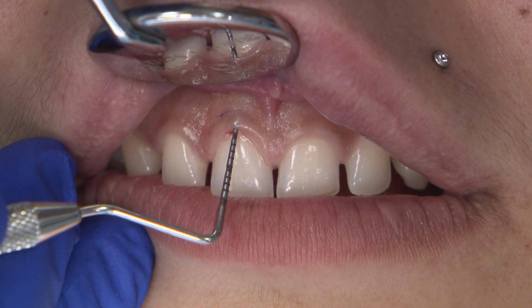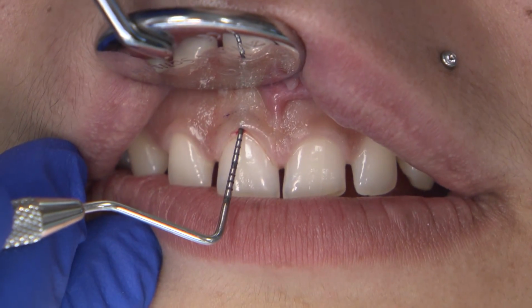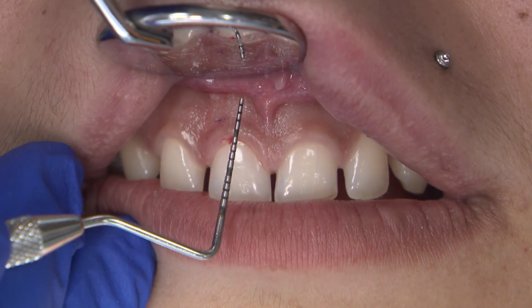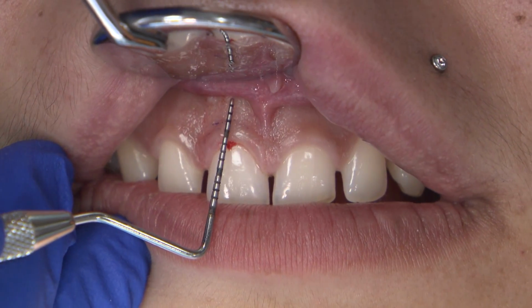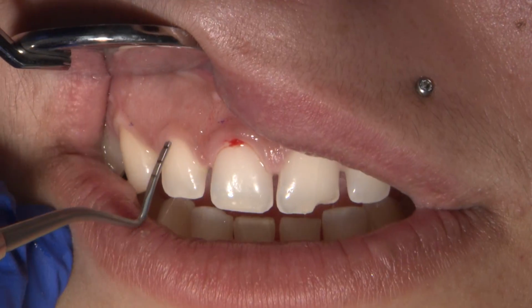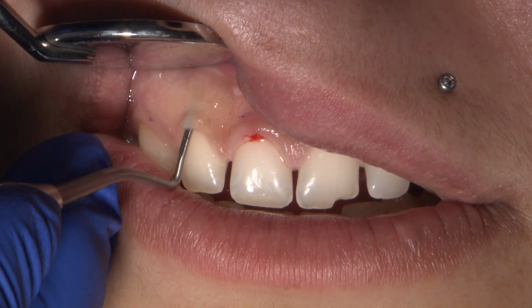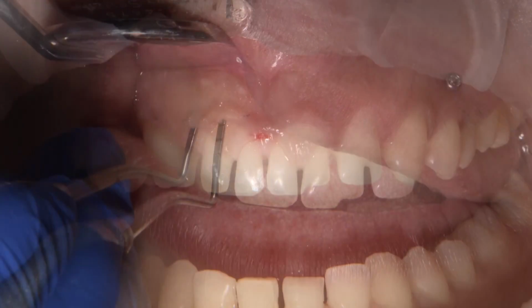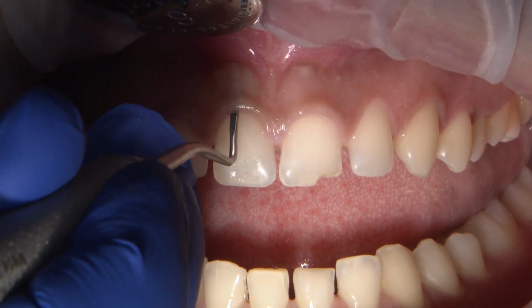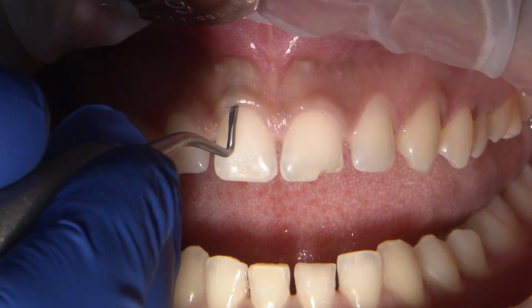Next step is to sound down the bone using a perio probe or a bone sounding gauge to decide if I need osseous recontouring or just gingivectomy. This will give me an idea of how much tissue can safely be removed to improve the tooth proportion and correct the gingival asymmetry. I like to use the bone sounding gauge because it is easy to manipulate and provides easy access due to its curved tip.